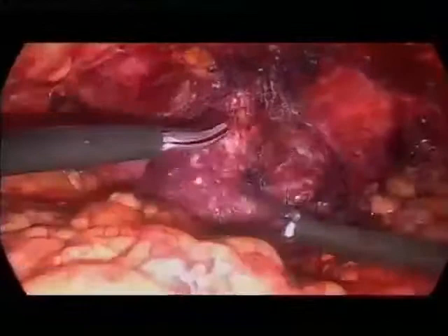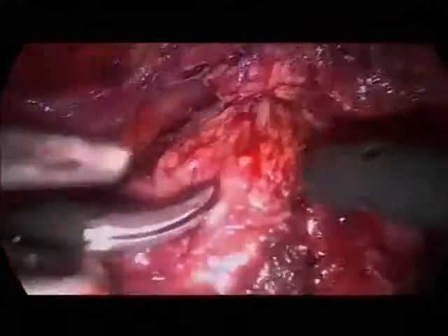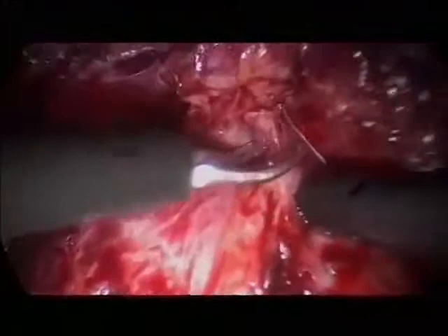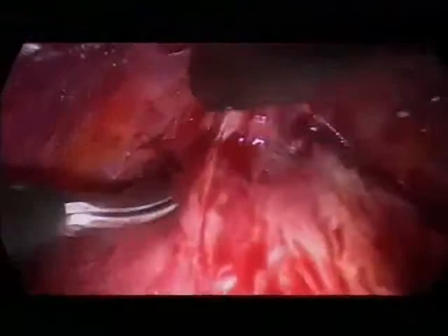So, the apical dissection is actually a three-step procedure, the ventral part. We have already cut, you see that, this is the Santorini plexus. And here is the orientation, the prostatic capsule. Now we cut the junction between the so-called external sphincter, and you see the plane here, and the apex of the prostate. It's always easier to see the margin between the urethra and the prostate here laterally. You see it very nicely.